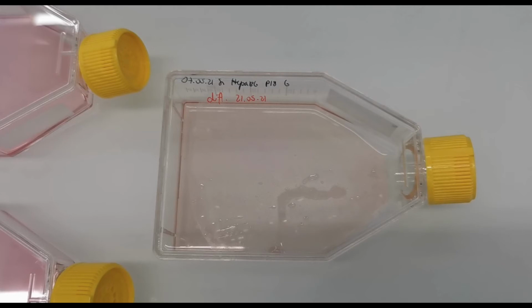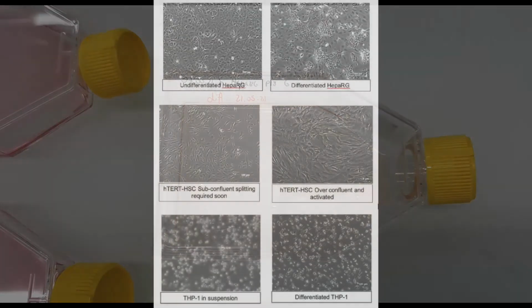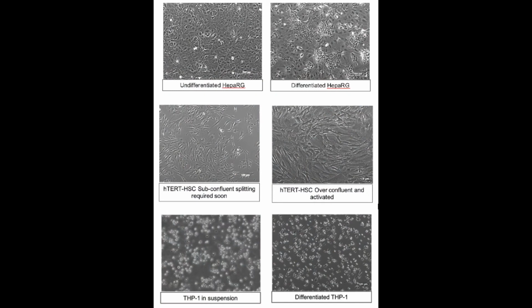Cells should be observed prior to starting, so check for confluency and record passage number. Passage numbers are important for our cells, as THP1 can only be used up to passage 30. The HTERT-HSCs can be used up to passage 12 and the HepaRG up to passage 20. We also check microscopically the differentiation status of the HepaRG and the THP1 cells. And of course, we check for spontaneous activation of stellate cells to ensure the cells are in the appropriate condition prior to starting.